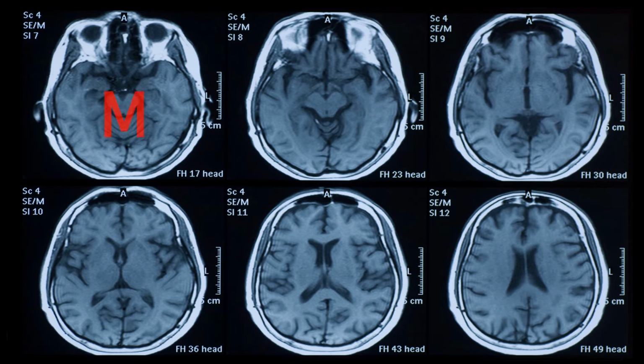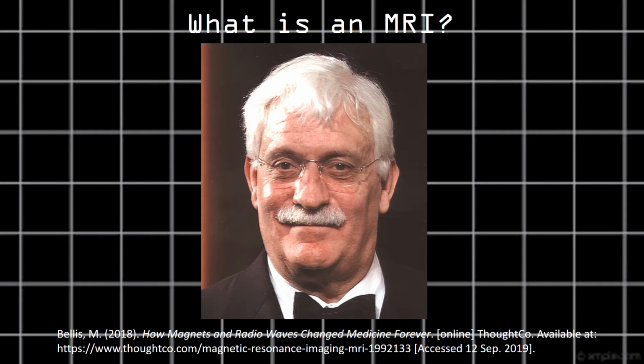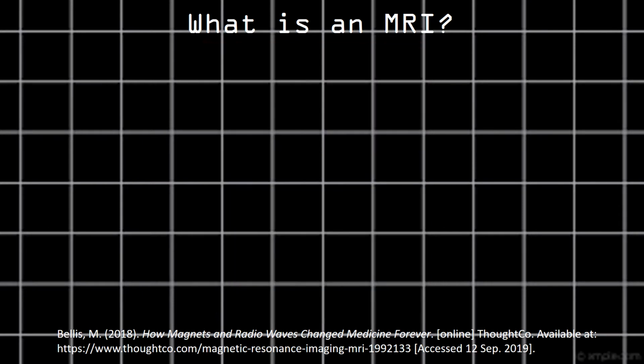Medical imaging using waves, the MRI. In 1971, Raymond Damadian proposed a machine that could function as a medical imaging process, which featured the use of magnets and radio frequency waves. In 1977, Damadian built his idea and named it Indomitable. Today, we know it as an MRI.